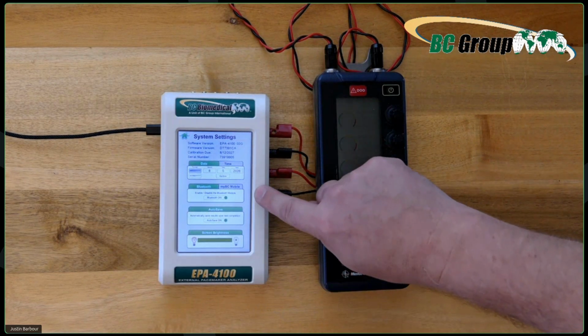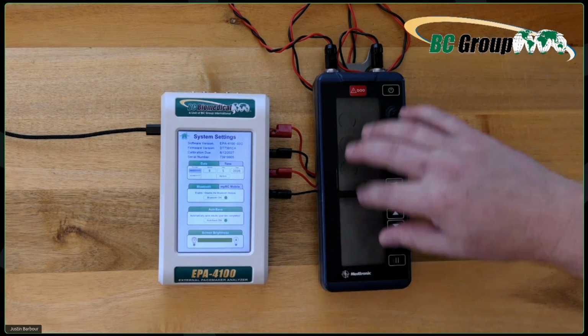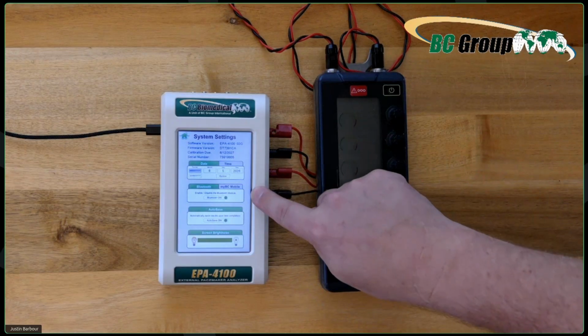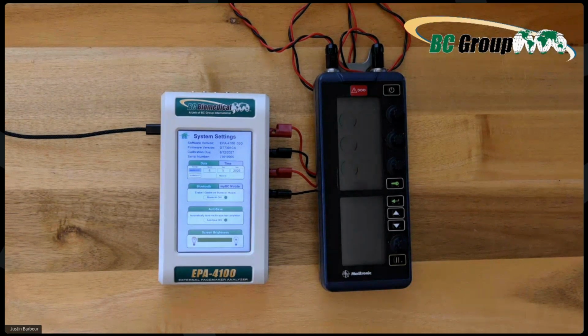Now, I've seen some preliminary testing on that, and it's very fast. Like, it's extremely fast going through. It tells you what button to press and where you got to go. But be mindful, all BC Group's new products are going to be using Bluetooth. That's because we can do automated testing. And if you guys have never seen automated testing, it is so much faster and it's so much more accurate and reliable.